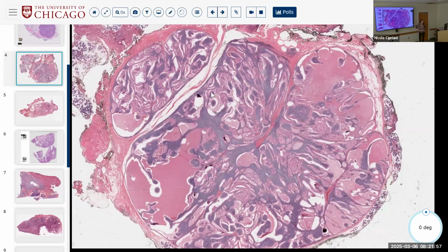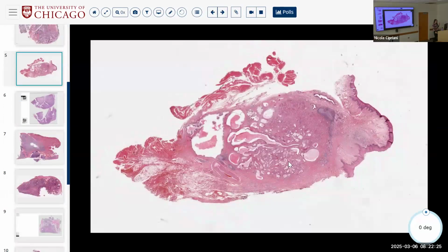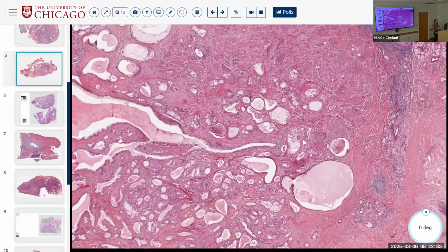But the same goes, I don't think I have an example here, I'm not sure. The same goes for oncocytomas, right? So oncocytomas that are oncocyte rich and stromal poor also have that same biphasic distribution of P63, P40 positive oncocytes at the parabasal location, at the stromal interface. Okay, so you can use that to your advantage if you have a differential diagnosis of another tumor. This maybe being an example of one of the things that could occur on your differential diagnosis.